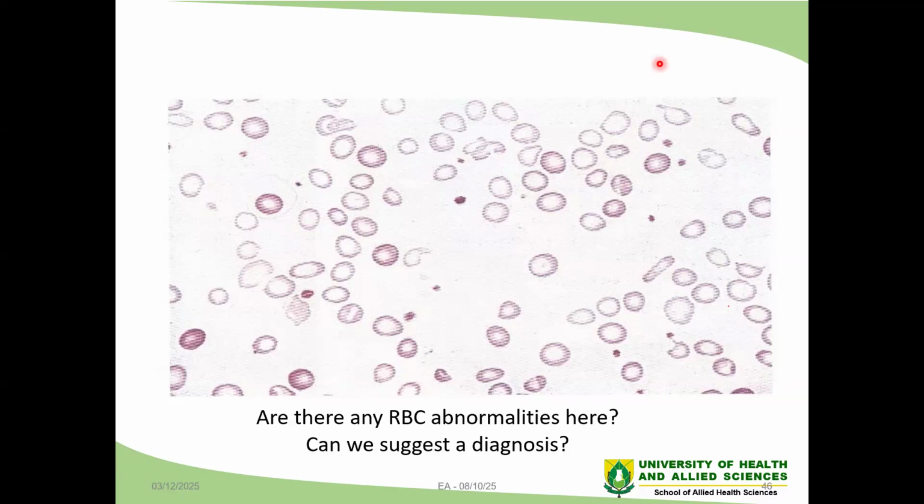My name is Adams, and I'm also seeing a wider pallor of the RBCs.